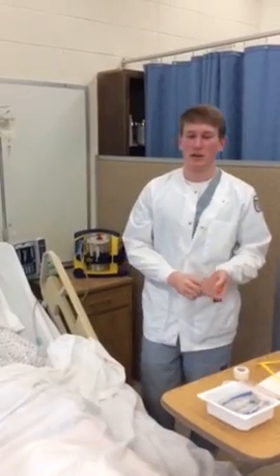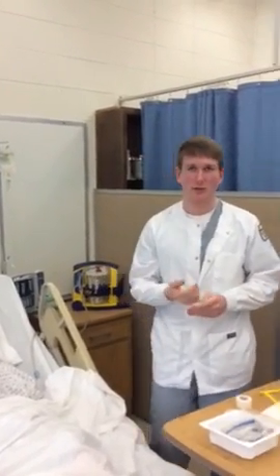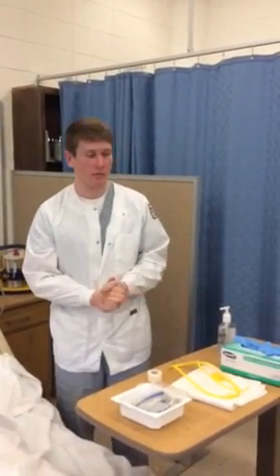Okay, this is NG tube insertion, and I'm going to begin by reviewing the order for the NG tube and then medical history regarding deviated septums and nasal surgery histories. And then I'm going to gather my equipment, which I have right here, and then perform my hand hygiene.